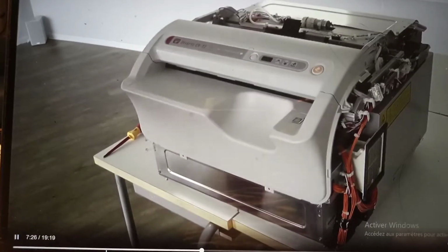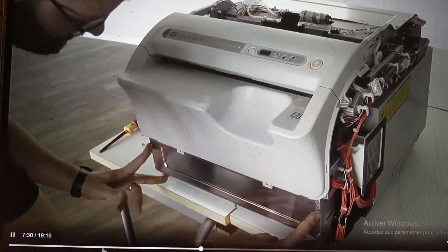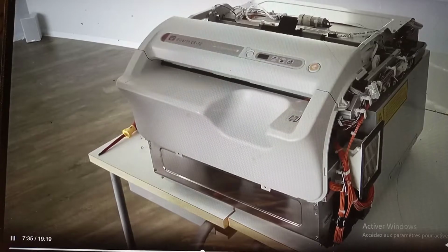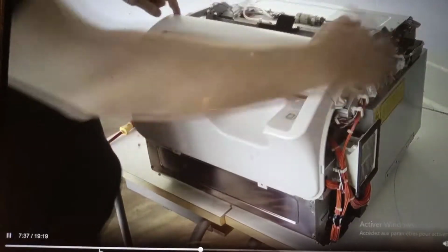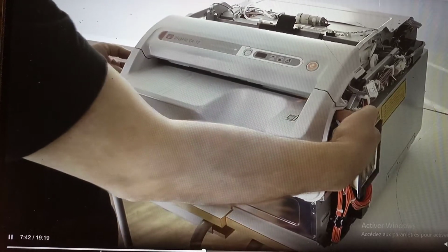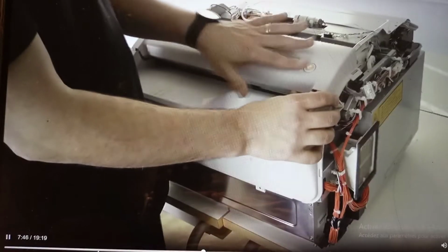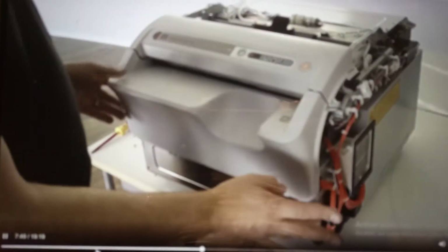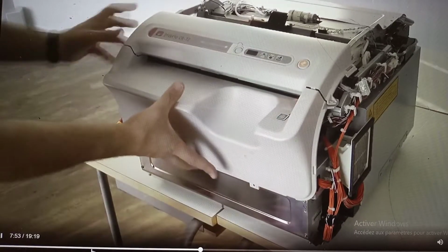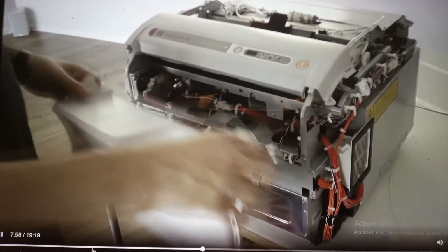The next step is to remove 4 screws here, 2 on each side, to remove the lower front cover. Then remove these 2 screws on top and these 2 screws from the side, so the top part with the display is loose. Remove 2 screws here and 2 screws here to have this part loose, and now you can remove the single parts.